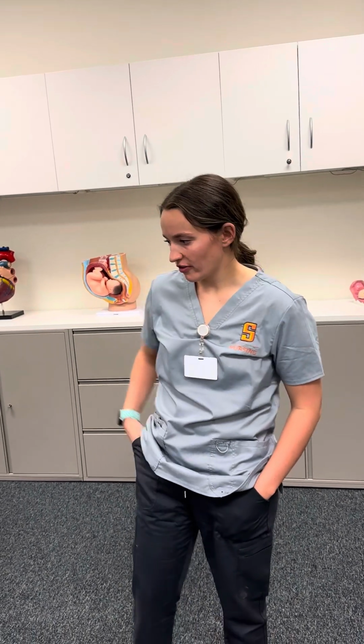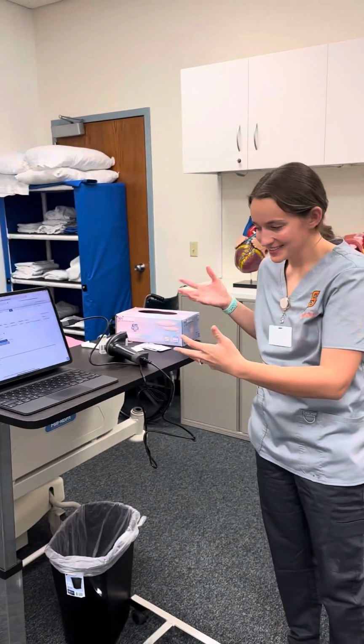Okay, my name is Kaylee Dyring and I am doing the intramuscular injection pass-off. So before going into the patient's room, I would gather all my supplies. And I have all of my supplies right here.